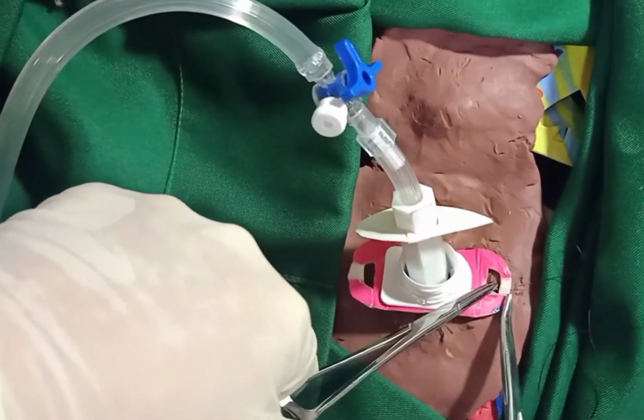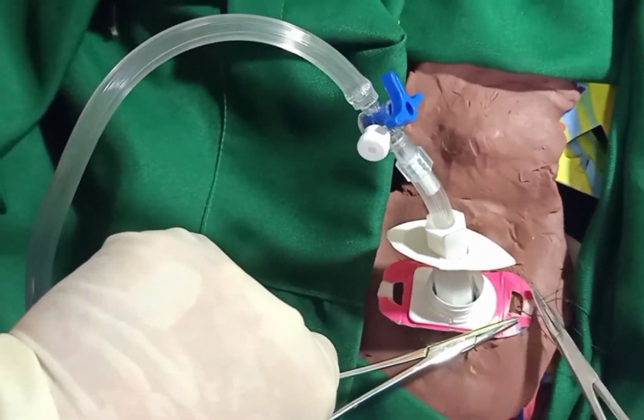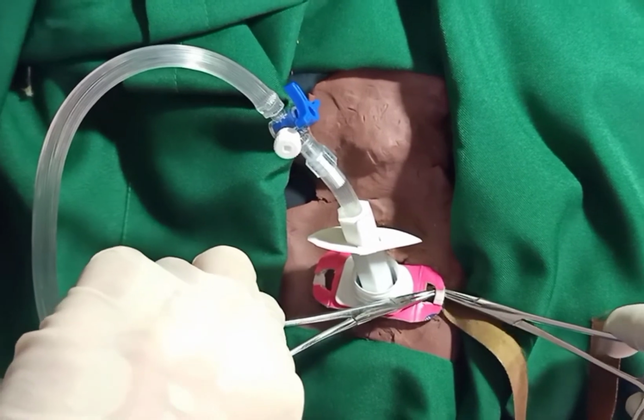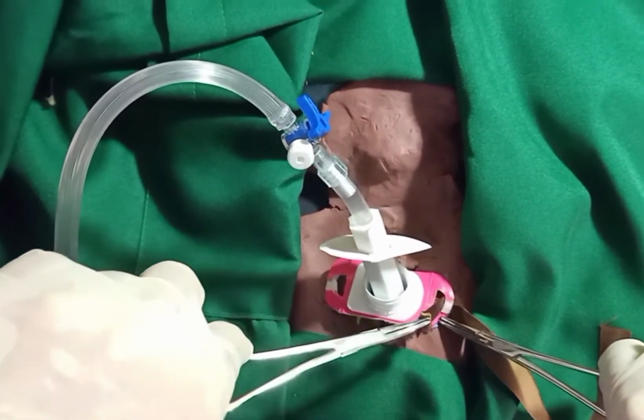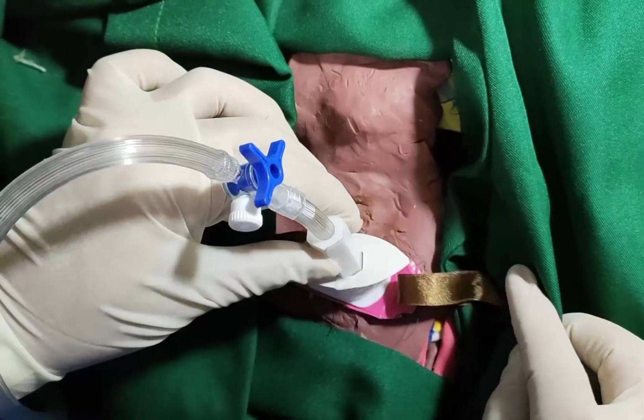I will now secure the tracheostomy tube by suturing it around the skin but not too tight to avoid surgical emphysema. Now thread the tapes through the holes in the flanges of the tracheostomy tube and pass them around the neck. Tie them with the neck flexed.